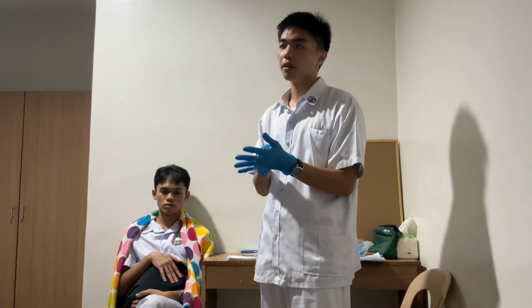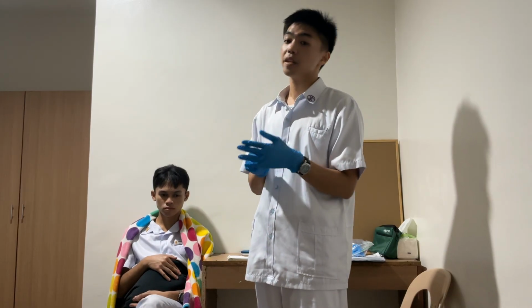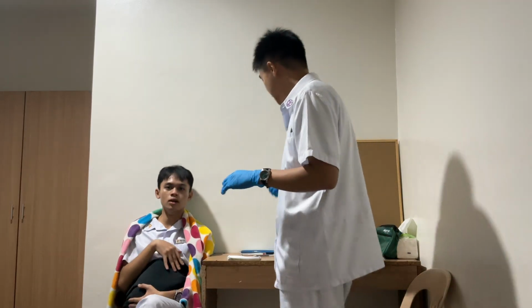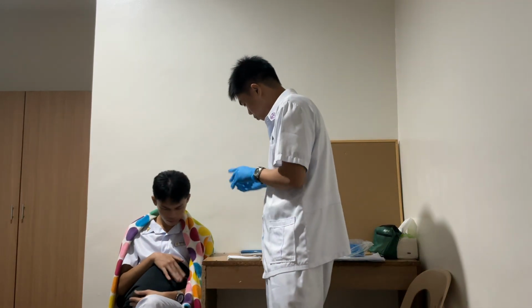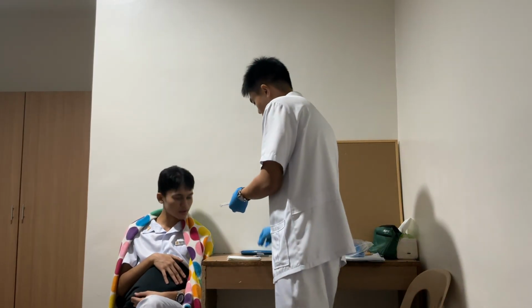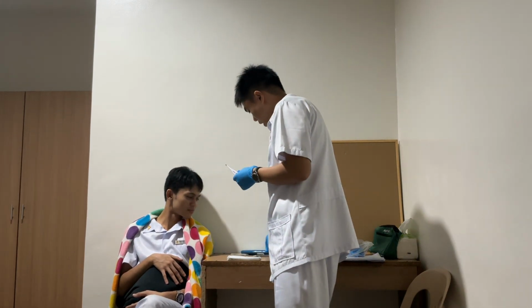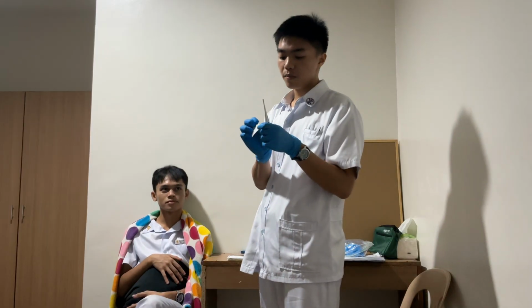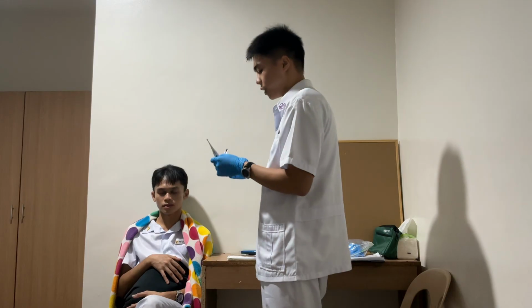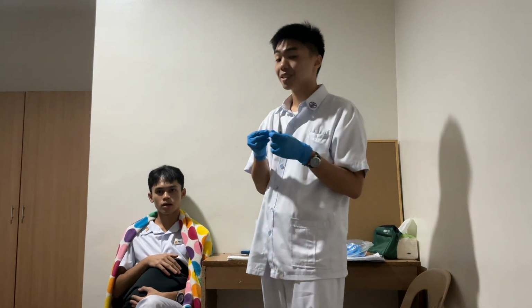But in cases of rectal temperature taking, then we can let the patient position in a lateral or Sims position, if we are going to insert a rectal thermometer. This time, I'll be showing how to, you can also check, ma'am, to ensure that we are handling a clean thermometer. We have here the thermometer, then we have here an alcohol swab. It is the wipes with alcohol. It will help us disinfect.